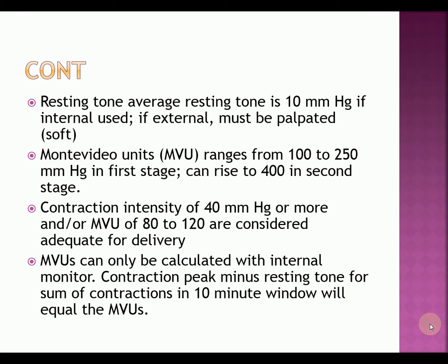So the Montevideo units can only be calculated with the internal monitor. Remember that. You cannot do Montevideo units any other way.